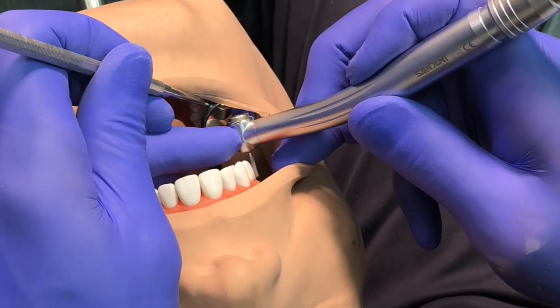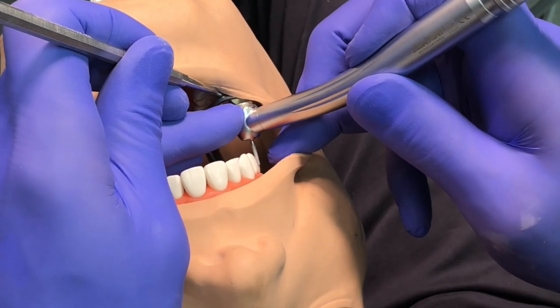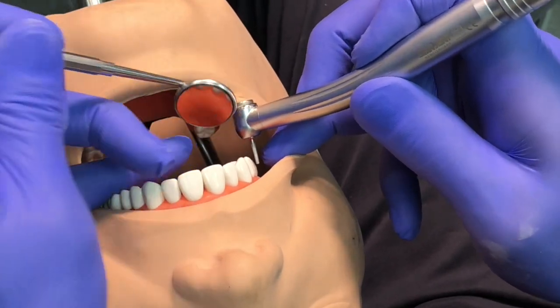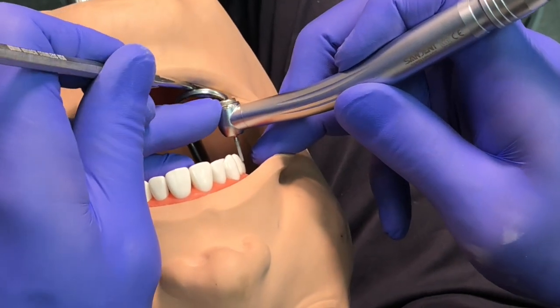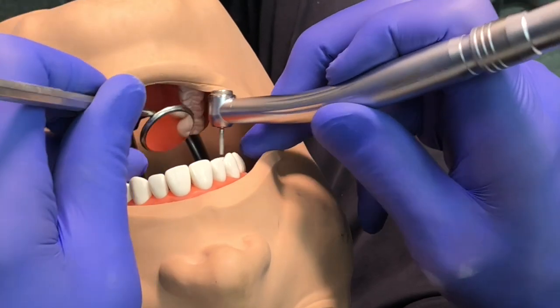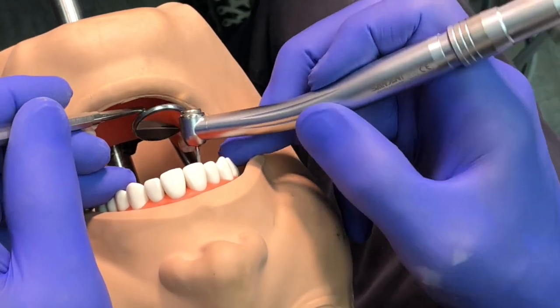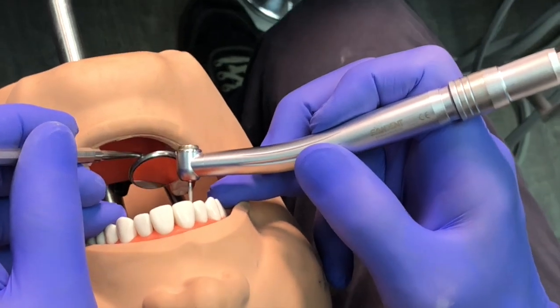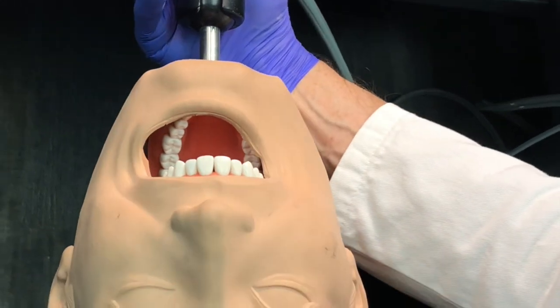If I can't get a finger rest on the same side, I can also use a finger rest on the opposite side of the arch, stabilizing the handpiece that way. I'm retracting the cheek with the mirror or finger, getting the mirror in there. You can even use the finger of the opposite hand to stabilize the handpiece — pivoting off that finger. Pretty much everything on the maxilla is easy from this position, with the exception of buccal surfaces.